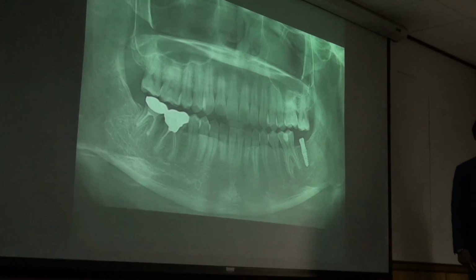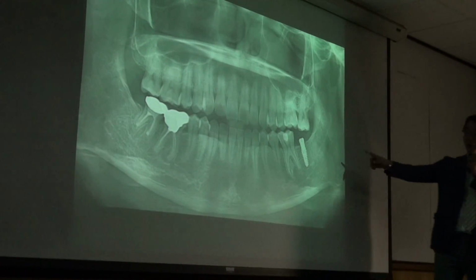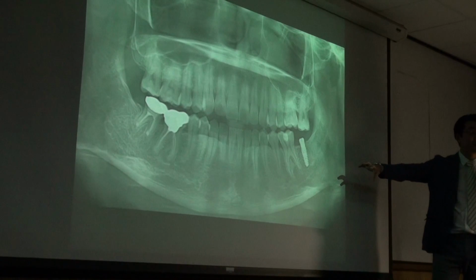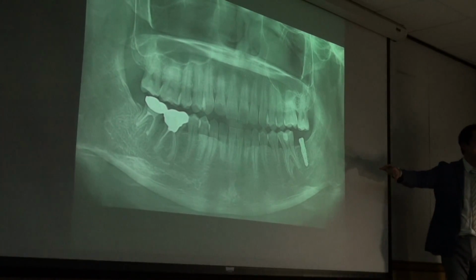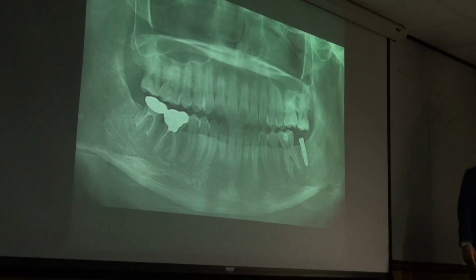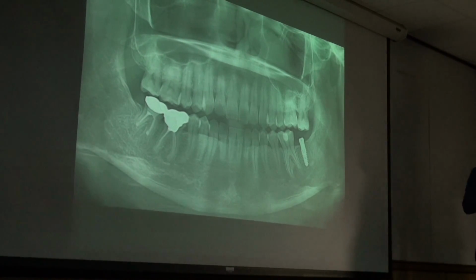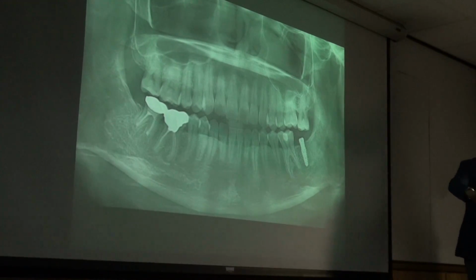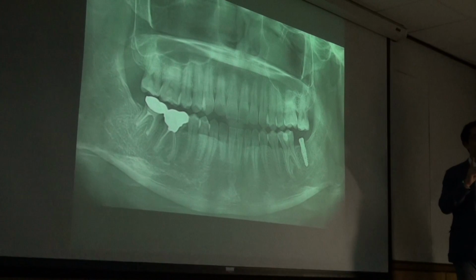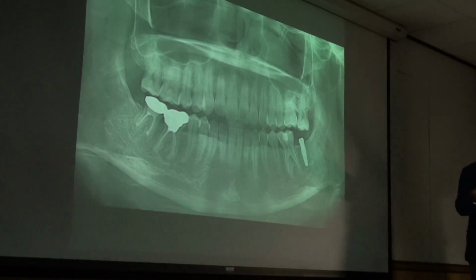If you have some brave heart, after 3 months, you can apply the reverse torque, right? That's one of the scientific ways. But I don't have that kind of brave heart. I cannot apply the reverse torque. So the only non-invasive way is the ISQ.